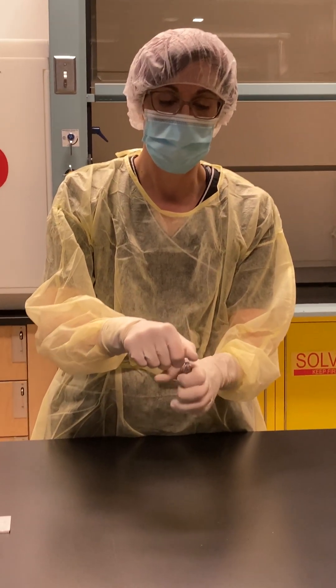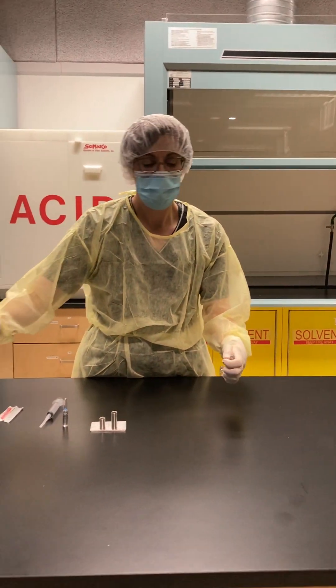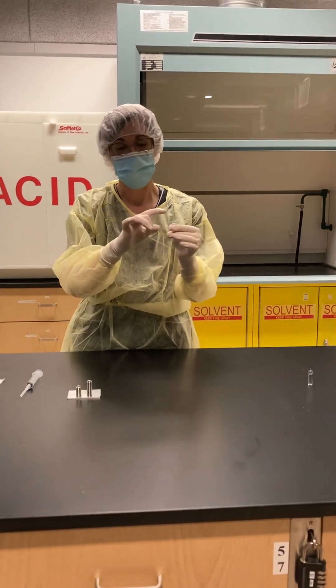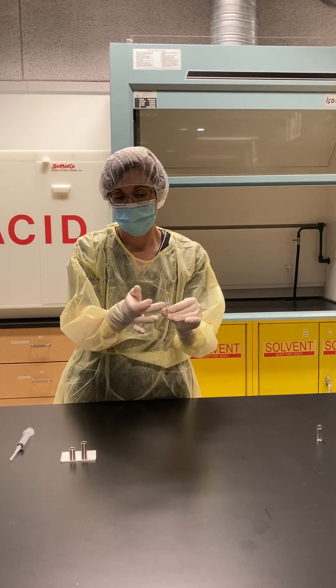You're just going to grab the ampoule and snap. Now, if you're worried about cutting yourself, another way to do that is — and you always want to make sure there's no more fluid up there, so you can flick it if there is any.